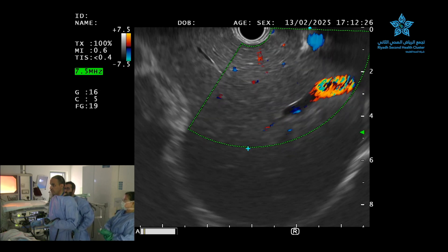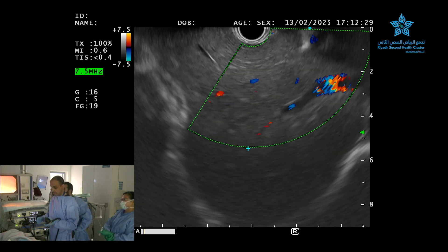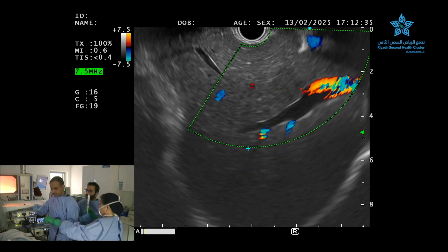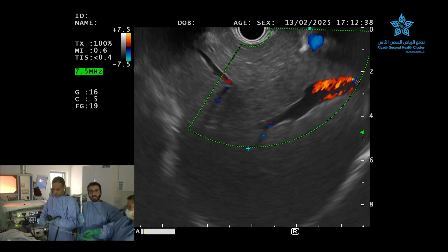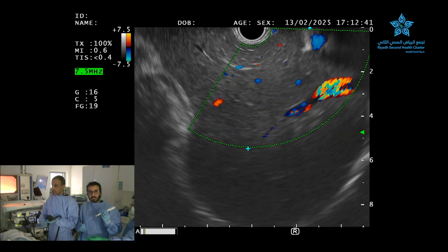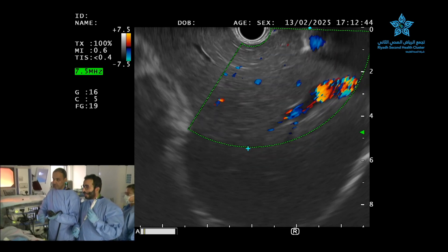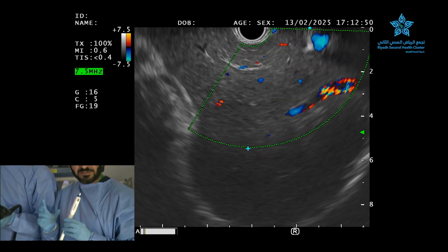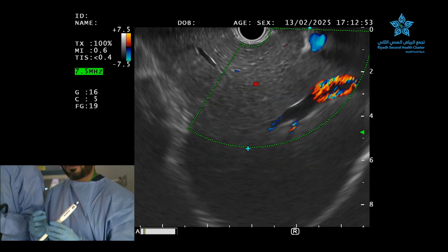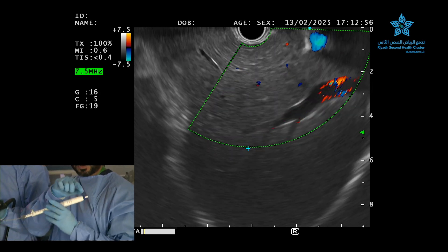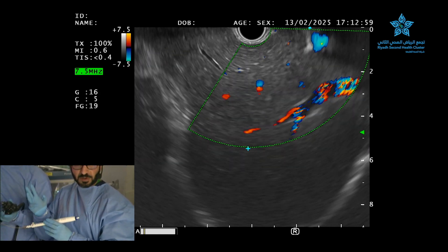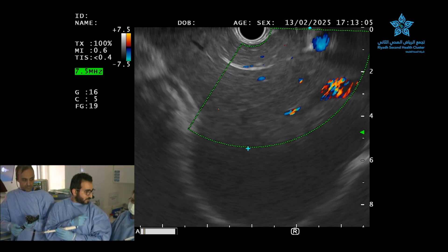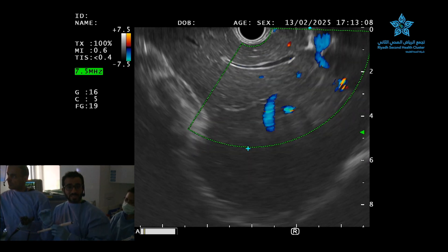For liver biopsy there are different techniques. All the studies show that the wet heparin suction technique is the way to go. We have the needle here — we are using the EasyShot Olympus EasyShot 3 needle, and we already took the stylet out. We already prepared five cc of heparin. We put two cc of heparin in a negative pressure syringe that we will hook to the needle, with three cc remaining. One cc will be used to prime the needle. The needle was primed with a one cc heparin column — all the needle now has heparin inside.